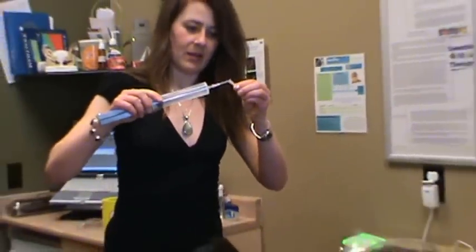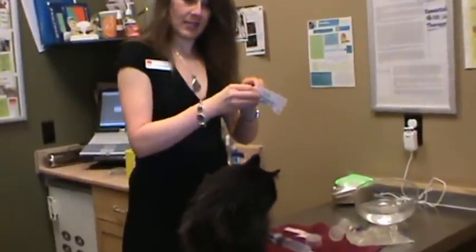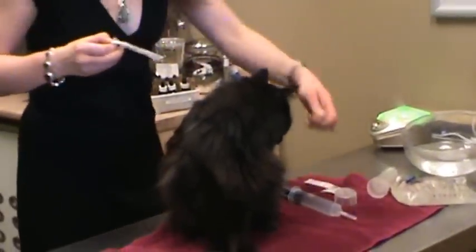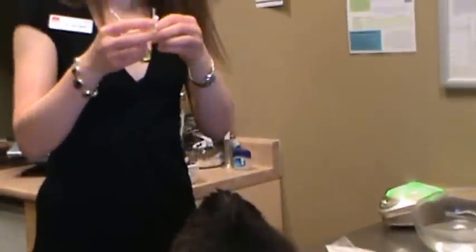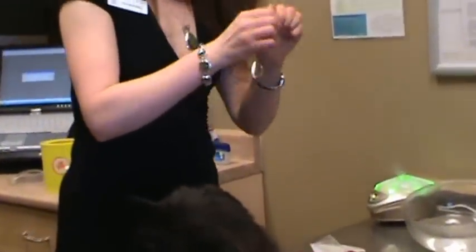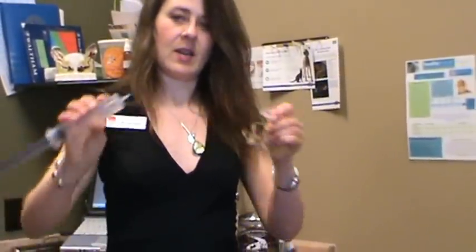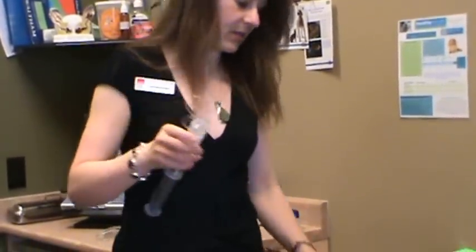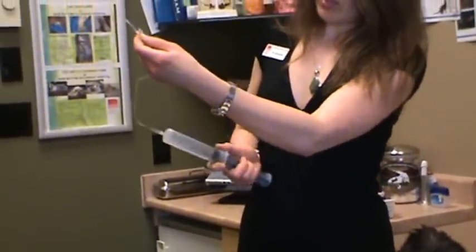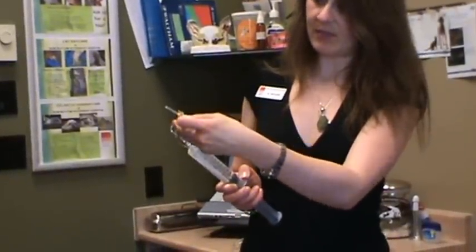Then I like to put the cap back on, and then I grab my subcutaneous fluid administrator — this butterfly catheter — and it helps administer the fluid a lot better. I take the butterfly catheter out of its package, undo the top, and then I insert the butterfly catheter onto the syringe where we're giving fluid, so you take off that needle and put on the butterfly catheter needle hub. Then I like to release the air bubbles by depressing the syringe a little bit so that all of the air in the line is gone and I have 100% fluid in my line.